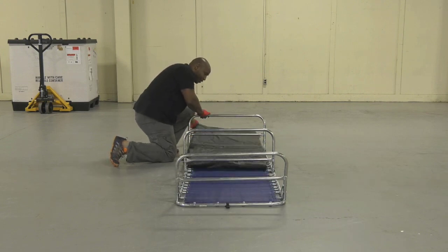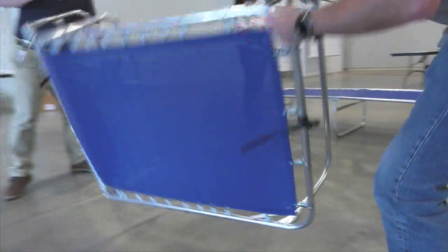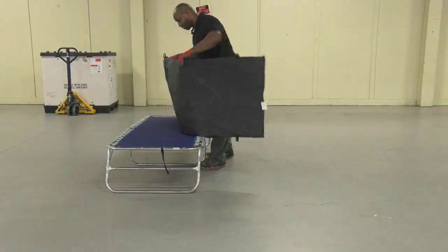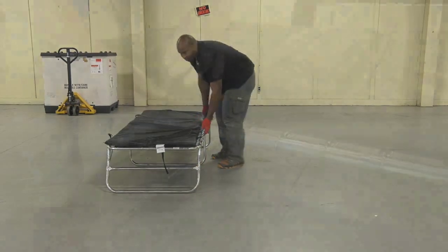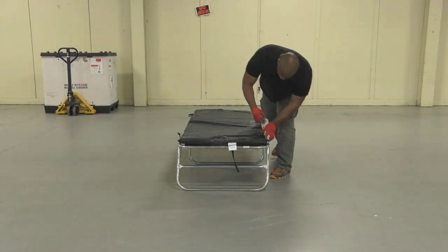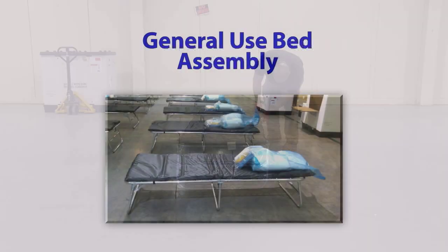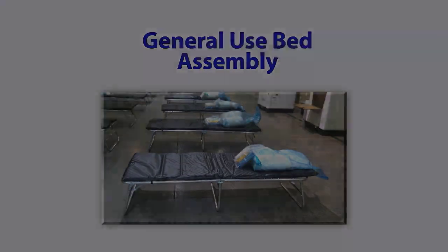Remove the mattress by sliding it out from underneath the bed frame. Now turn the bed over and place the mattress onto the bed frame. Use the four Velcro fasteners located at each end of the mattress to secure the mattress to the bed frame.